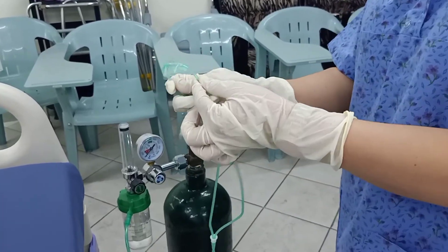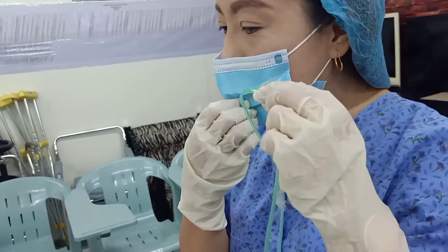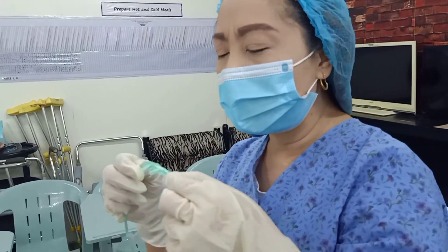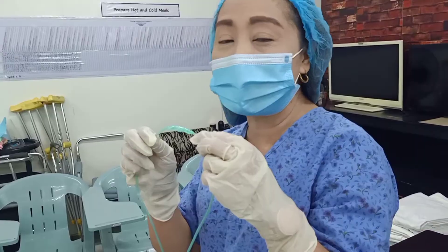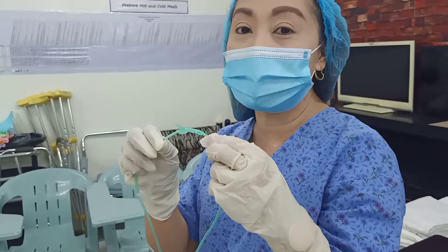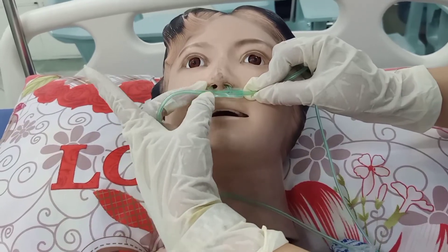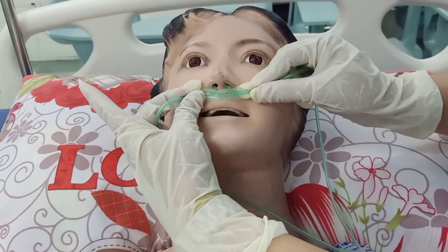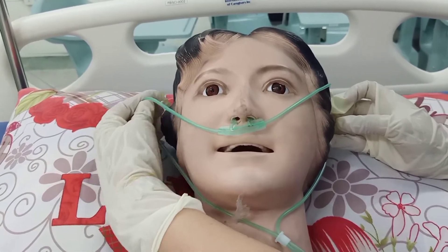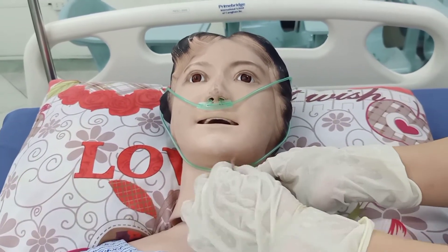Feel the cannula — you may feel it on your hand and also on your face. If there is a cool sensation coming out, it is not air, it's just a cooling sensation. That means that is the oxygen. Make sure it is comfortably inserted inside both nostrils of the patient. Then connect it on both ears, on the external ear, and adjust to the patient's comfort.